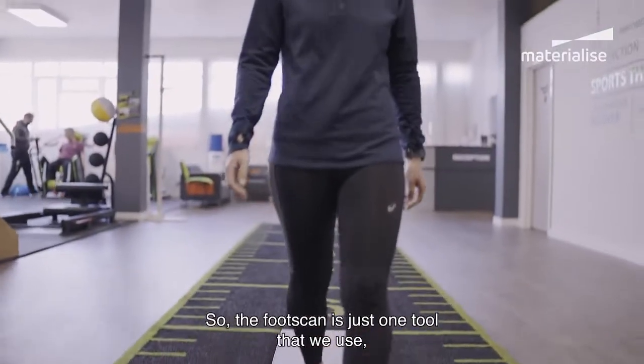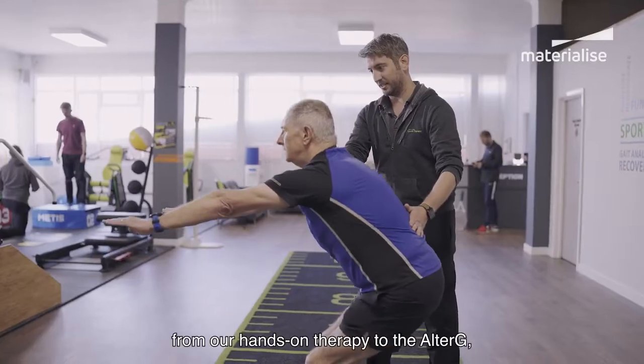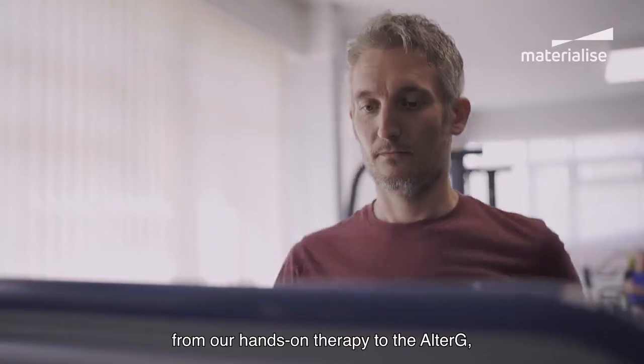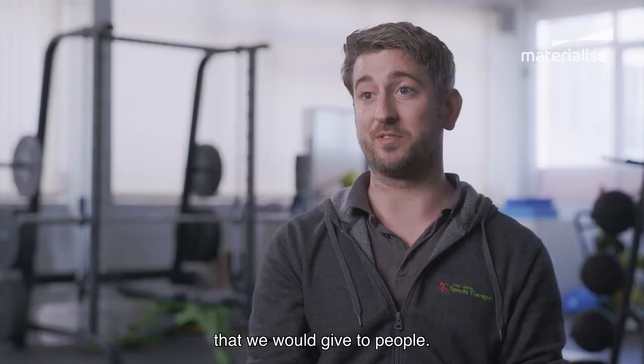The foot scan is just one tool that we use, but it complements everything else that we do — from our hands-on therapy to the Alter-G anti-gravity treadmill and the rehabilitation exercises that we give to people.